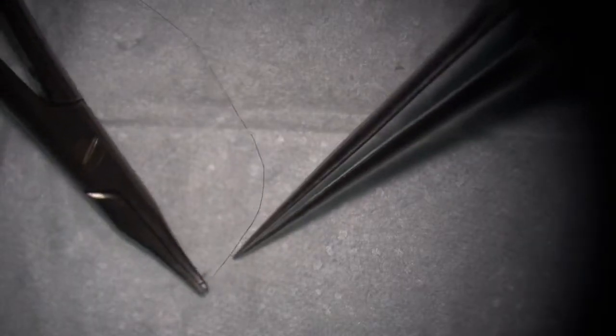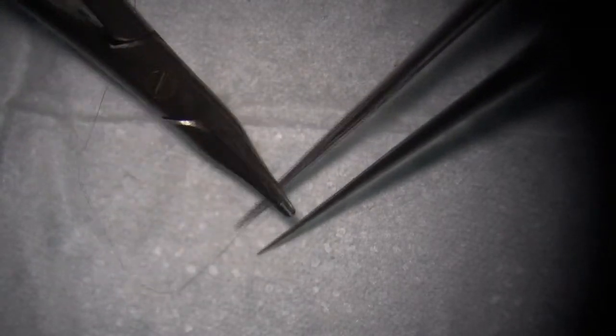So usually these are four methods of tying knots. Training method, the regular method we see in the OR, where we don't pass, pulling it up and down. And then when you're getting better, practice the airborne. When you're in a tough situation, if you don't have a good assistant, or sometimes you only have one person, use the airborne second. Try the simple one first.